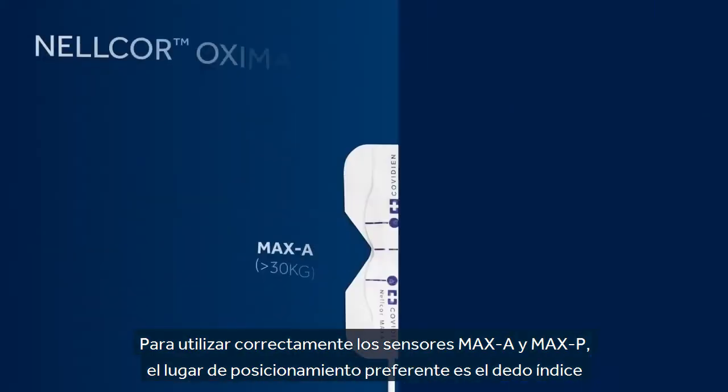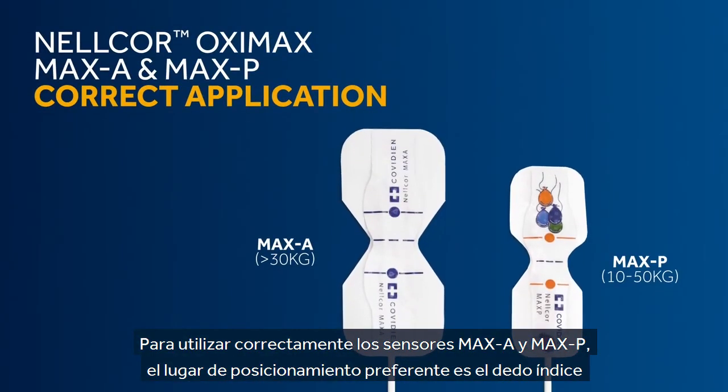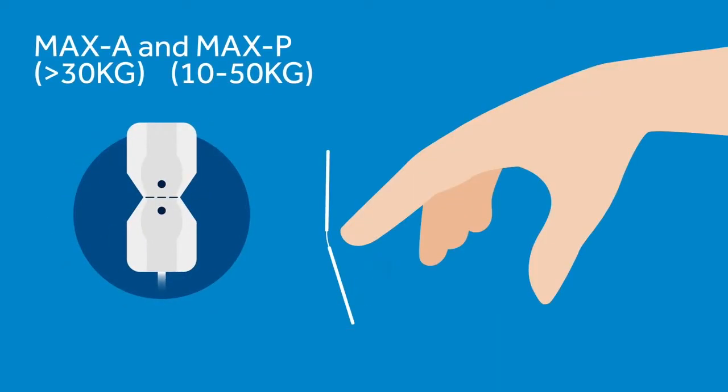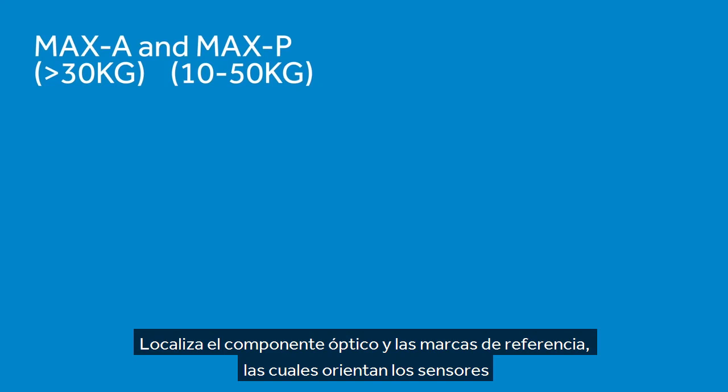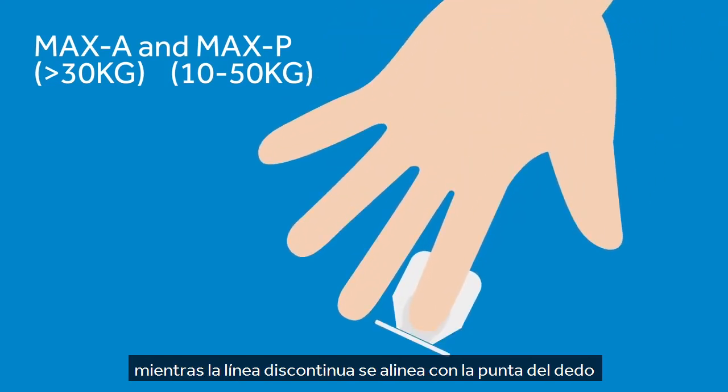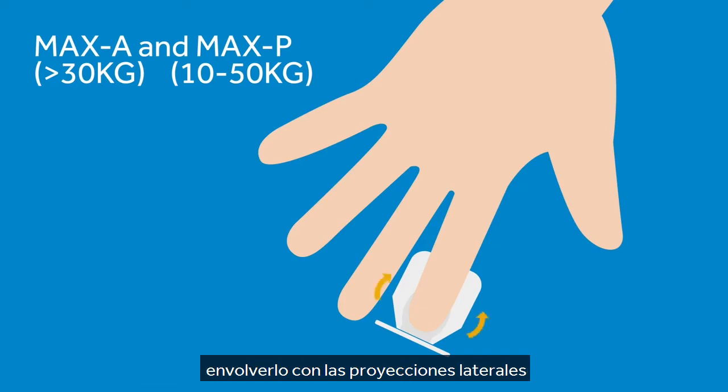To correctly apply the Max-A or Max-P sensors, an index finger is the preferred sensor site. Locate the window and alignment marks. Orient the sensor so the dashed line is centered at the tip of the finger and the windows oppose each other. Apply the non-cable half of the sensor to the bottom of the finger and wrap the adhesive flaps around the sides of the finger.